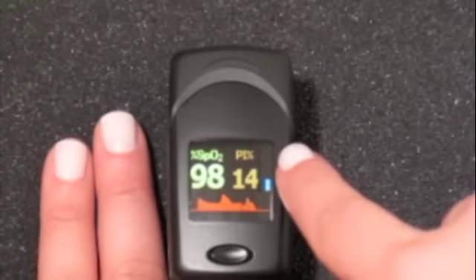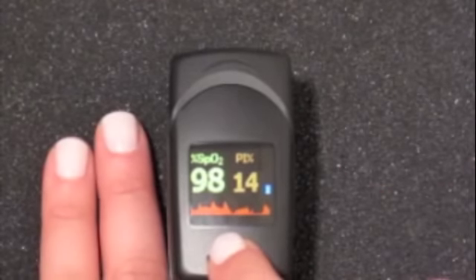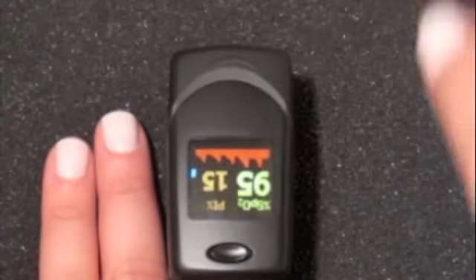The PC60C has multiple display capabilities allowing for four different directional views. Simply pressing the power button easily changes the view for convenient readings.